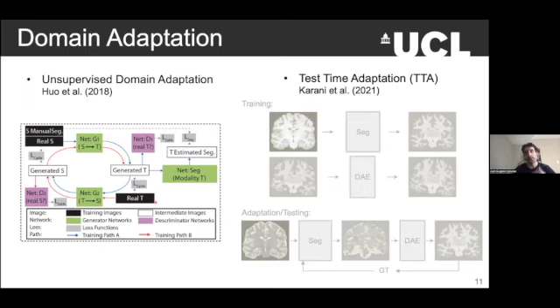So if you give me a bunch of 5 millimeter FLAIRs, I can use, for example, this super popular CycleGAN model, which is unsupervised, to learn how to translate one modality into the other. I don't know if you're familiar with the original paper that was turning horses into zebras. They were also turning, I think, photographs into Monet paintings or Van Goghs and stuff.